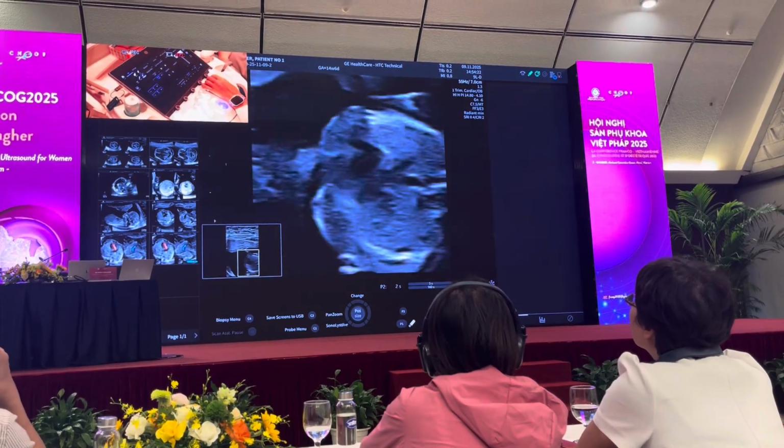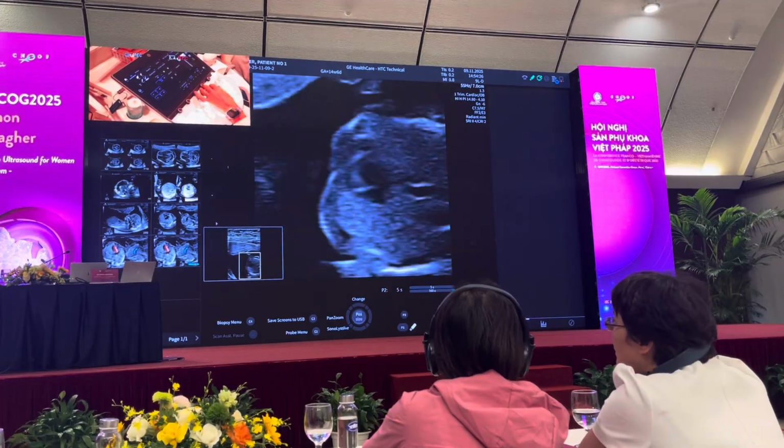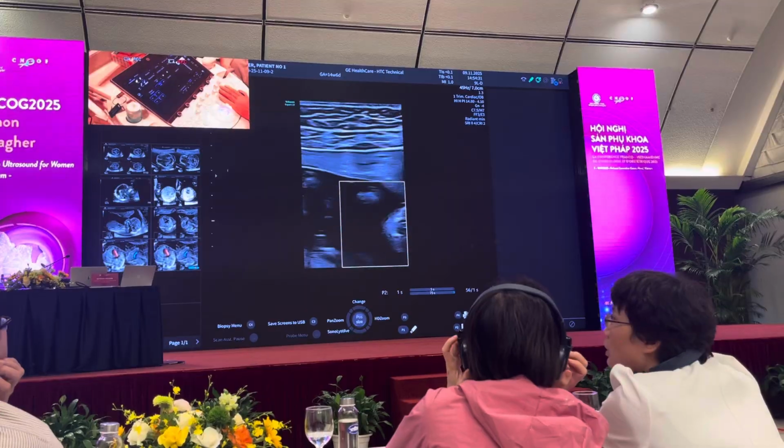So as I'm looking at this on the 4-chamber view, I'm looking to see whether the linear 9 provides a little bit more detail, but the baby has just moved already. So I might just come back to the heart in a second.